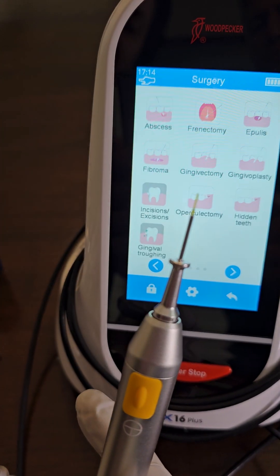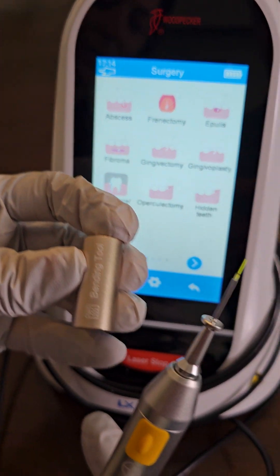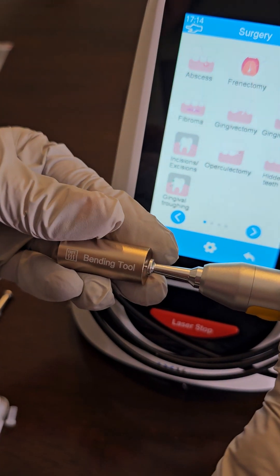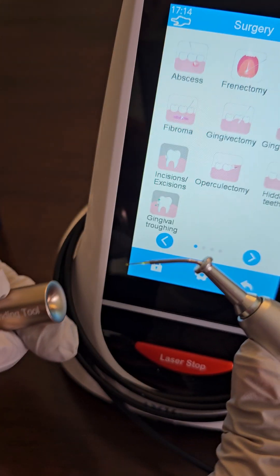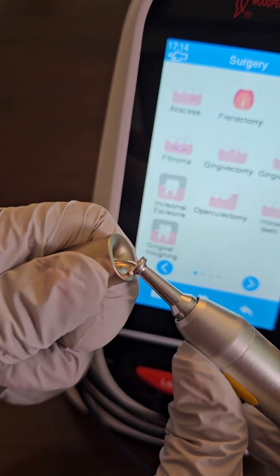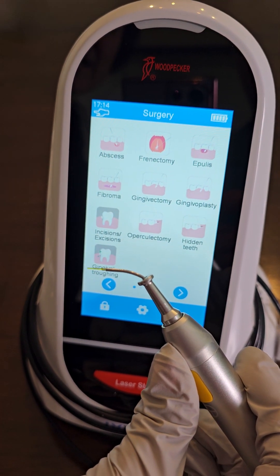Now if you wanted to bend the tip, you could bend it around an instrument, or it comes with a bending tool. You put it all the way in until you hear a click and bend it to your desired length — just make sure that it's not at 90 degrees.